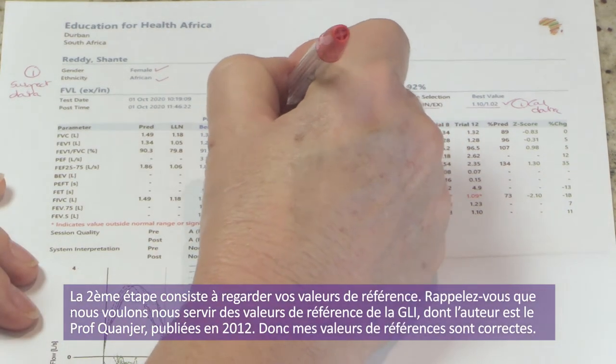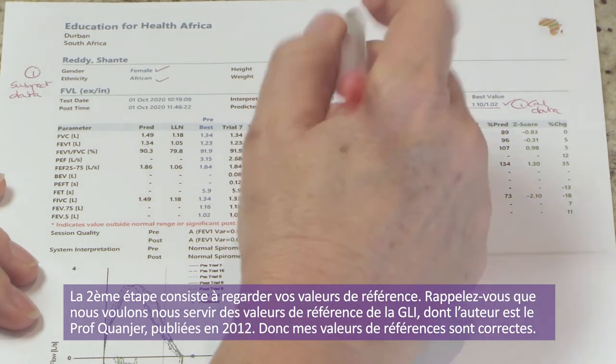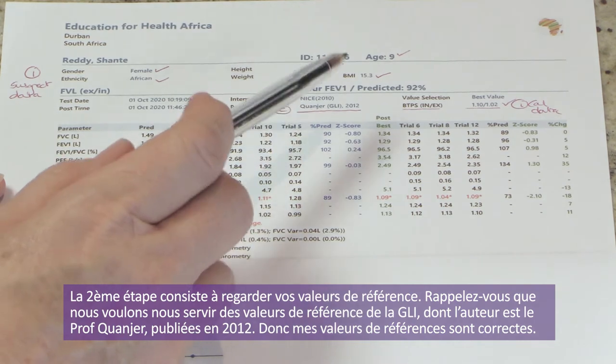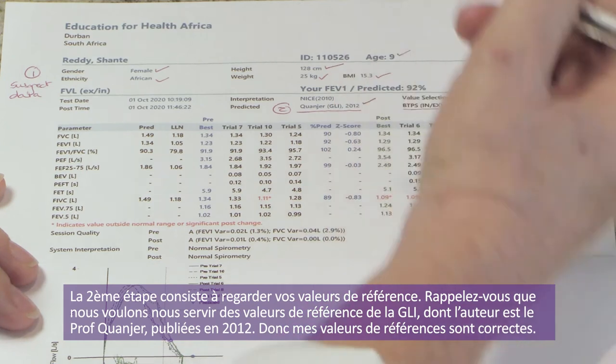Step two is looking at your reference values. We want to be using the GLI reference values authored by Professor Quanjer, published in 2012. I'm very happy that my reference values are correct.